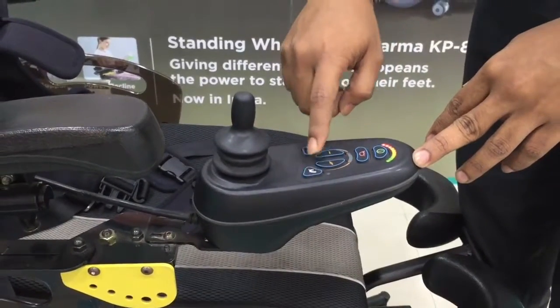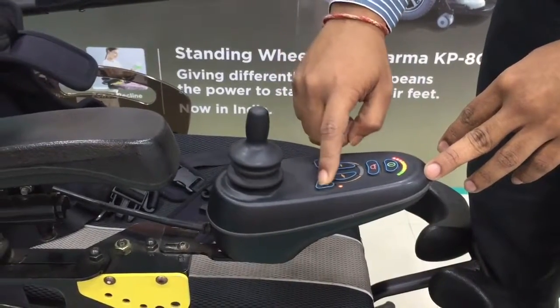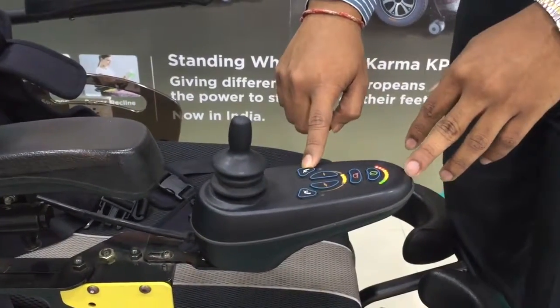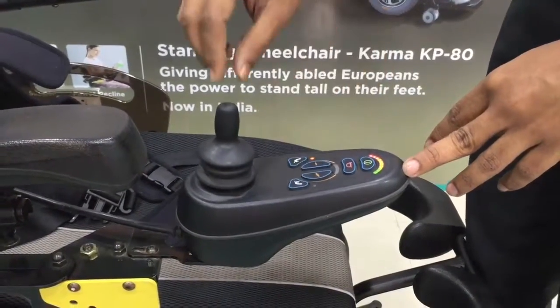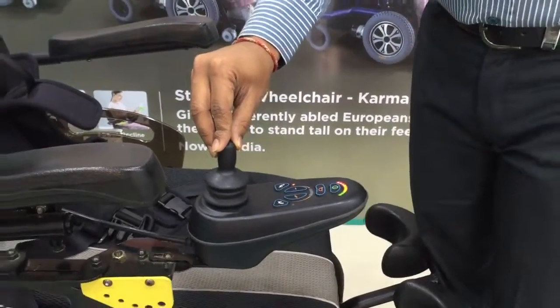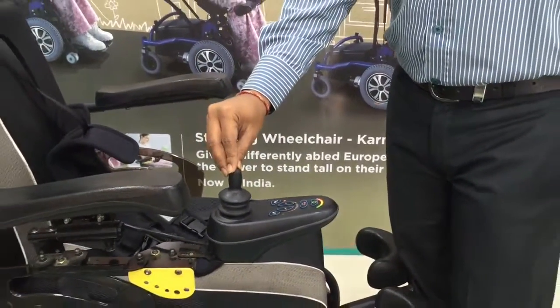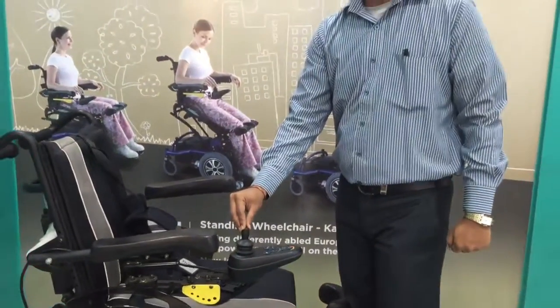These two buttons are required for the recline function and the standing function that the KP80 has. This is the recline button and this is the standing button. And this is the joystick knob, which you use to move the wheelchair left, right, forward, or backward.